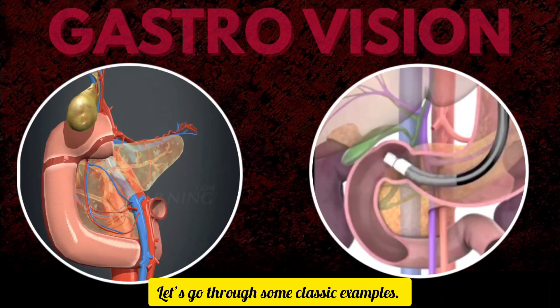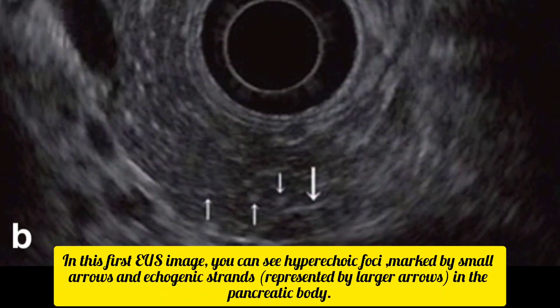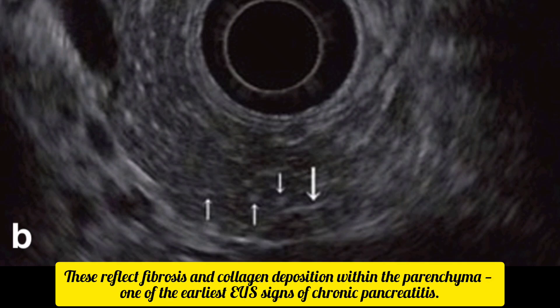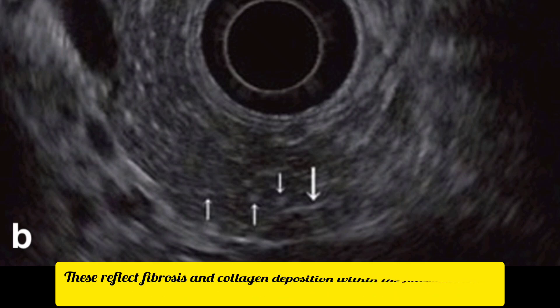Let's go through some classic examples. In this first EUS image, you can see hyperechoic foci marked by small arrows and echogenic strands represented by larger arrows in the pancreatic body. These reflect fibrosis and collagen deposition within the parenchyma, one of the earliest EUS signs of chronic pancreatitis.